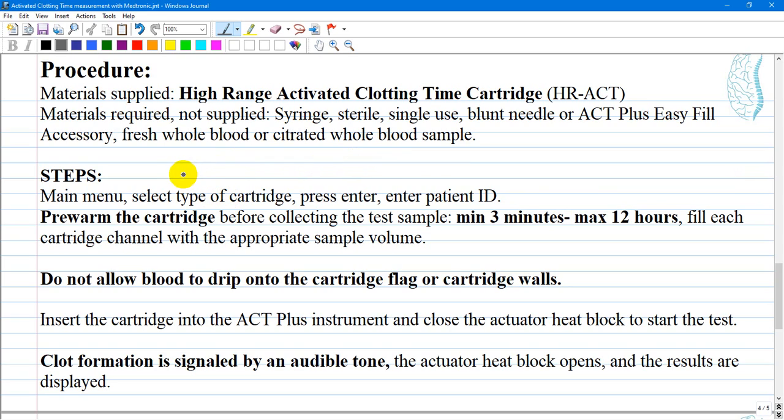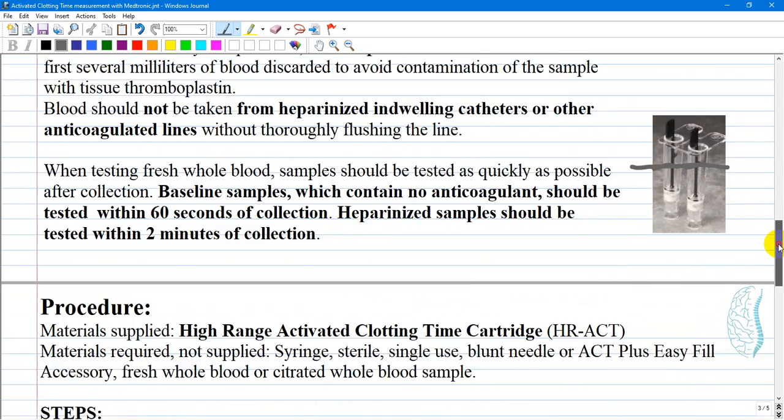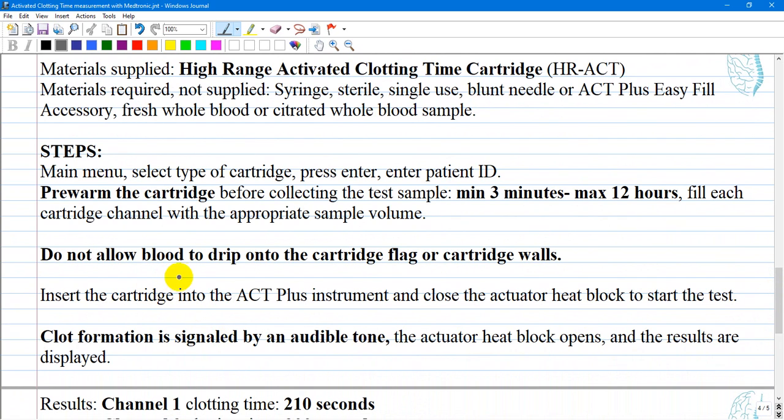When you are in front of the ACT Plus, turn it on and on the main menu select the type of cartridge, such as high range activated clotting time cartridge or HR-ACT. Select the corresponding cartridge you have in use, press enter, and enter patient ID. Before collecting the test sample, within 3 to 5 minutes or a maximum of 12 hours as shown here, you can pre-warm the cartridge. Fill each cartridge channel with the appropriate sample volume of blood — you will see an indicator of the right level. Do not allow blood to drip onto the cartridge flag or cartridge walls.